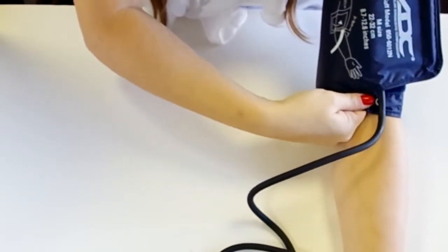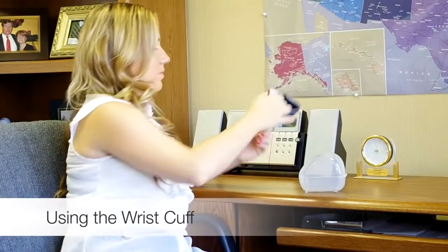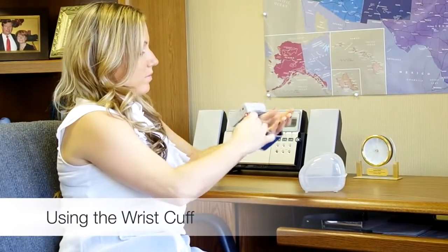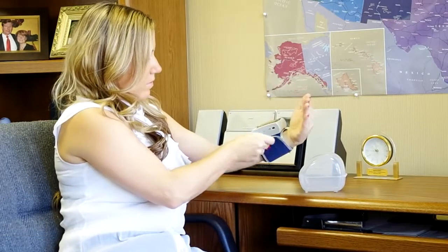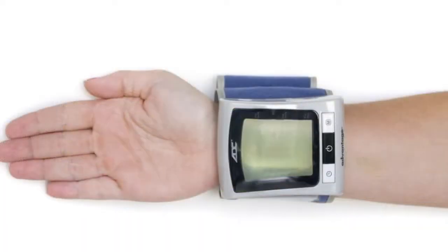The cuff should be just tight enough that you can fit two fingers under the edge. If you're using one of ADC's wrist models, remove any jewelry or clothing that may interfere with the reading before putting on the cuff. Hold your hand palm up and slide the monitor onto your wrist with the buttons facing toward you. There should be about a half inch between your hand and the monitor. The cuff should be secure but not feel tight.